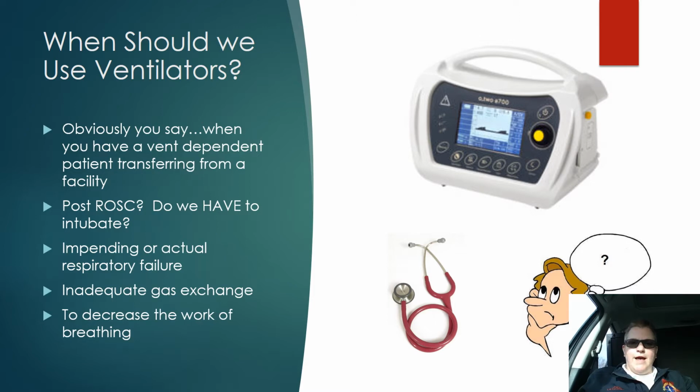Those patients that are fatigued and so worn out, their work of breathing is increased because of their disease process, and we decide to take their airway so that we can decrease their work of breathing and their body can go back into homeostasis. So our ventilators can help support them and provide their body time to do what it needs to do.